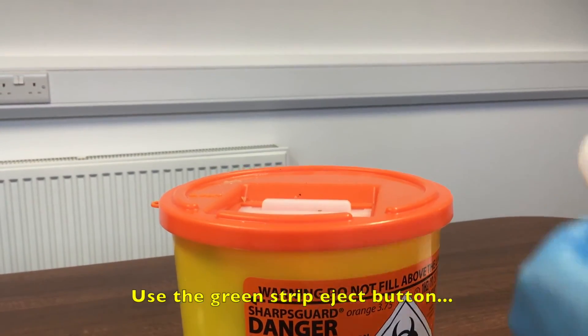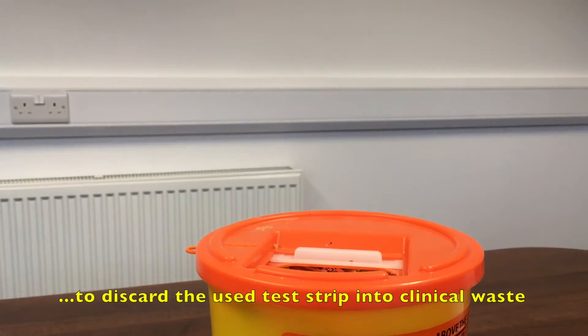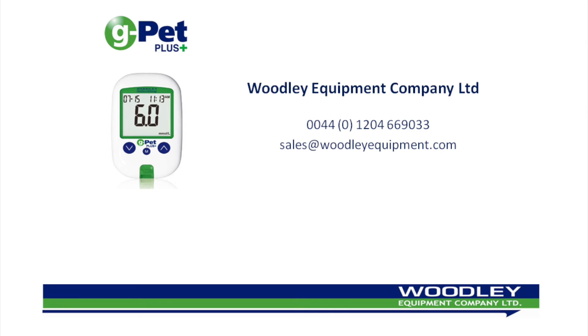At the end of testing, press down the green strip eject button to discard the test strip into clinical waste. Thank you for listening.